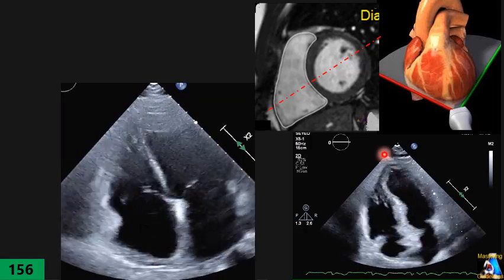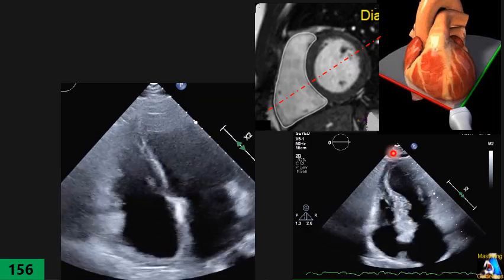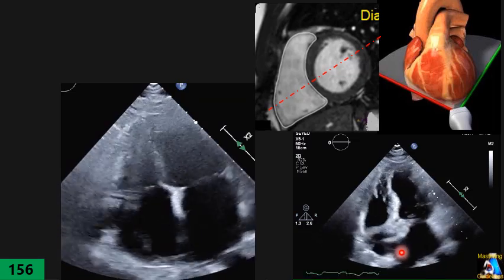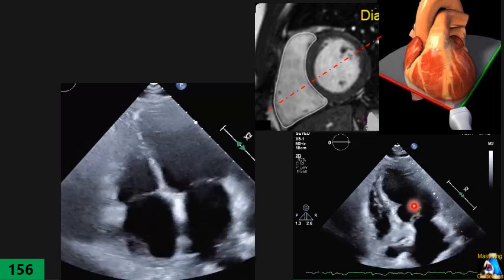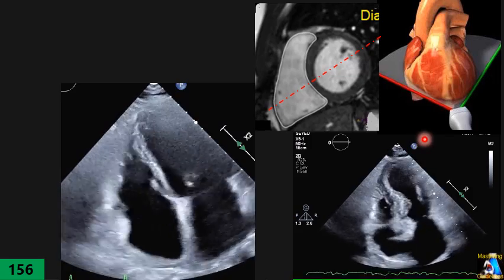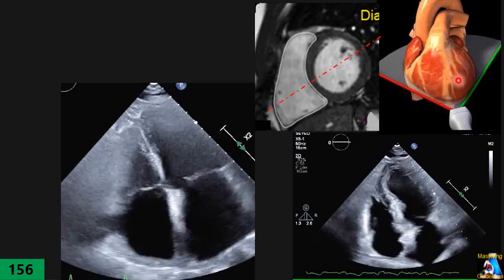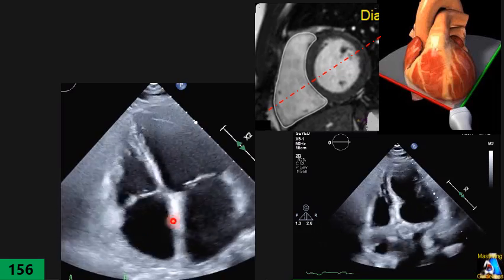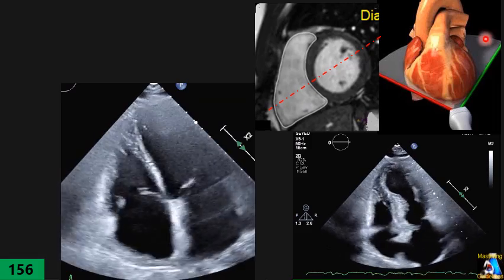Let's go before that, I want to give you a tip. The correct four-chamber view, RV focus or classic four-chamber, is the view in which all those chambers, both atria and both ventricles, are at their largest size in the same view. That is the general rule. For that matter, just sweep and twist a little counterclockwise or clockwise to make those four chambers, as you twist, you can see all four chambers at their largest size at the same time.